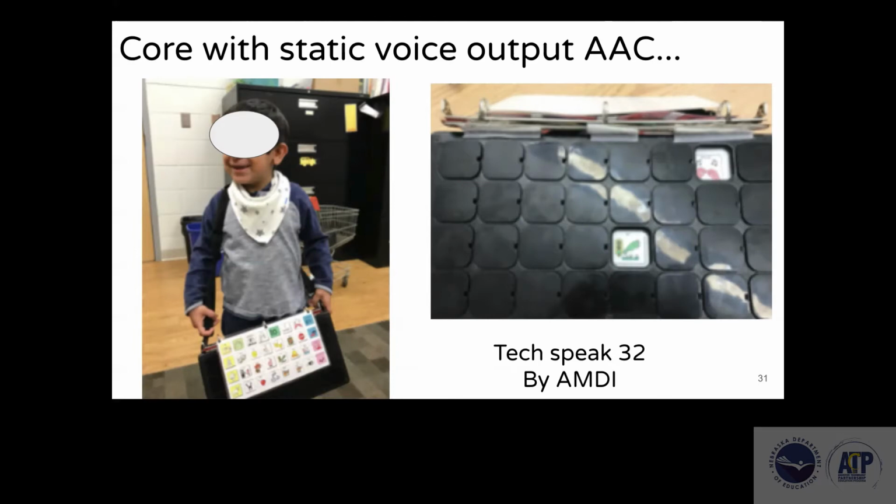And you can see this particular student loves his device and carries it with him everywhere. But you see the low tech board, the full board, on the front. I attached a binding, and we have his fringe on there, his personal core on there, as well as a full board for staff to model on, because we always want to make sure we're modeling as many words as we can on the full board.